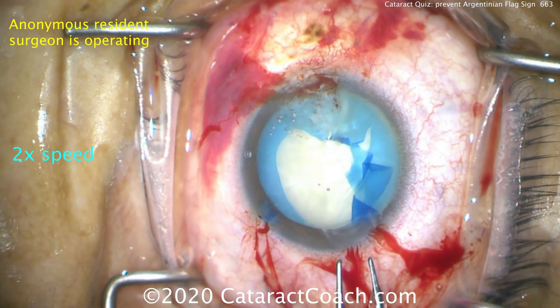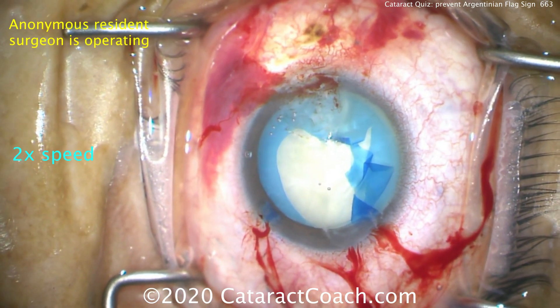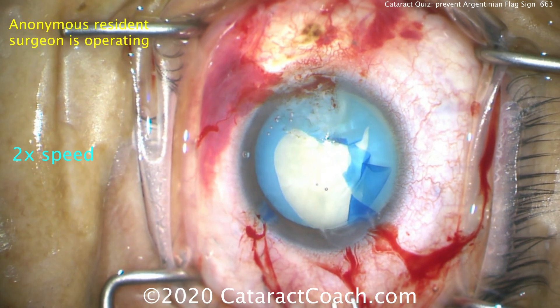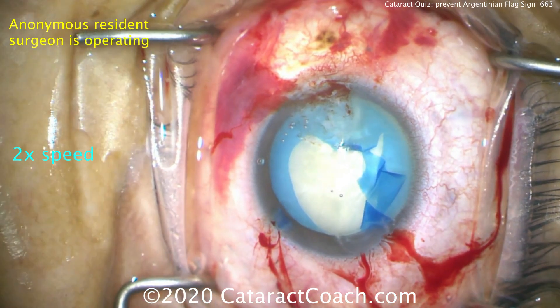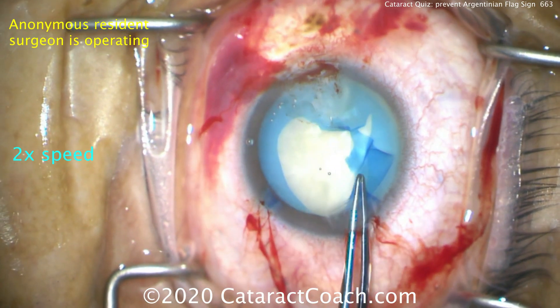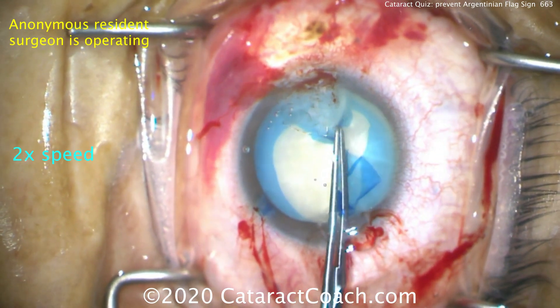Now quickly — see how it's moving out towards the lens equator again. Bring that back in. Try the little maneuver one more time. This is too much dilly-dallying, too much inaction. Get something done here. The longer you wait, the higher the risk. And remember, this video is at two times normal speed. Quit adjusting your positioning of your hands and instruments and scope — get to it.